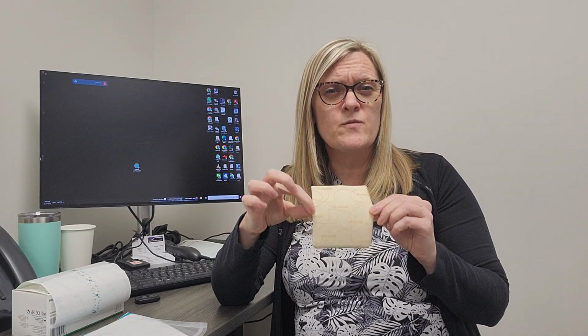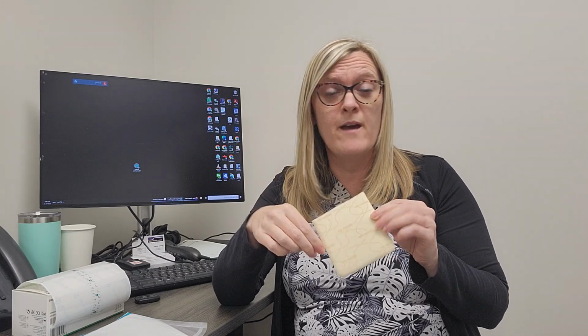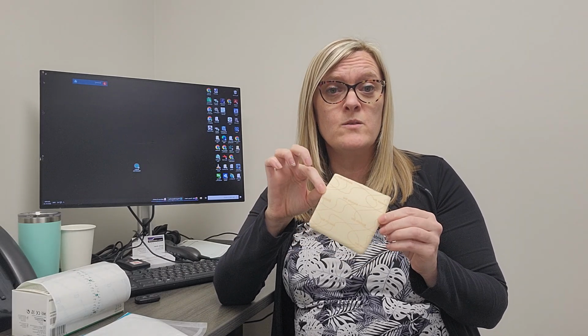I use this for a multiple variety of things, but one of the big things is that if you don't have any other type of foam, you can use this in place of the regular silicone foams that have full tack on the back. So what you really do want is a piece of non-adherent foam. I have the 4x8, so this is why it looks a little wonky here.